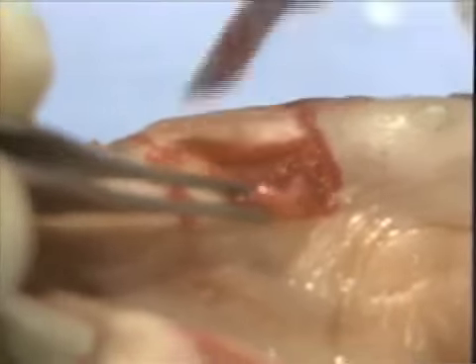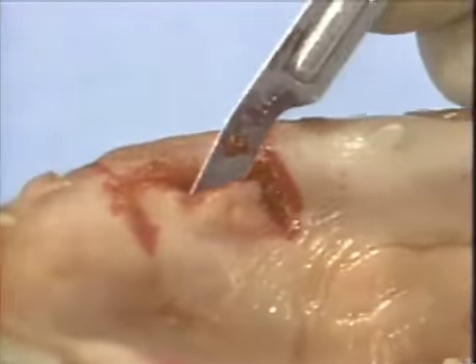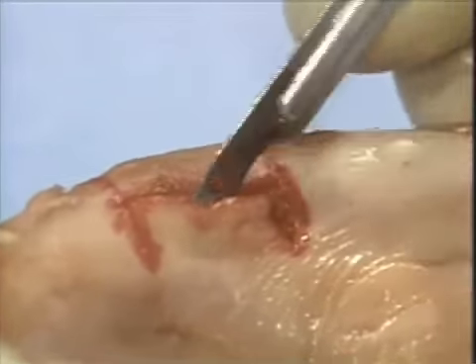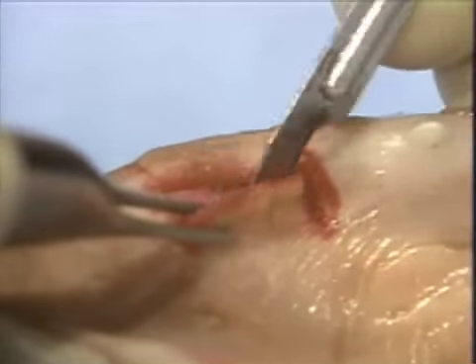As you can see, we are leaving a bed of gingival connective tissue between the surgical blade and the underlying bone. In a periodontal procedure, this underlying tissue would normally be removed, leaving an ideally contoured lingual flap.